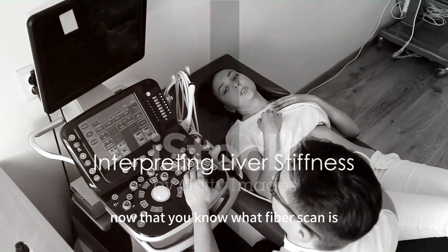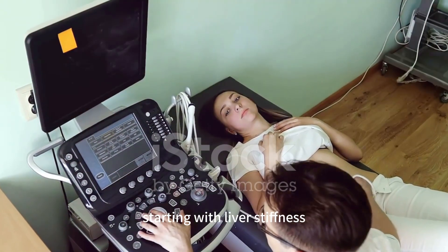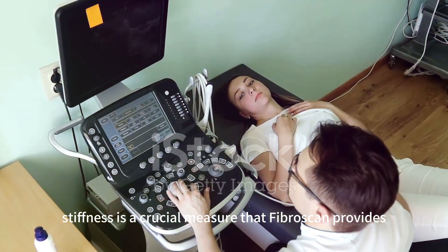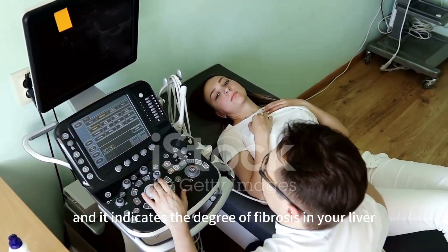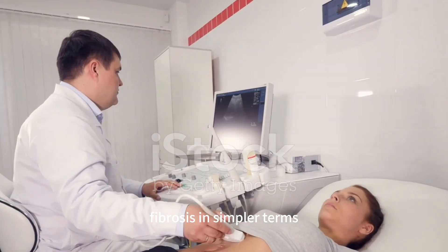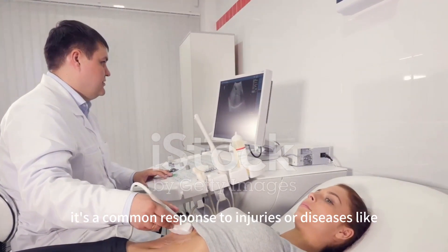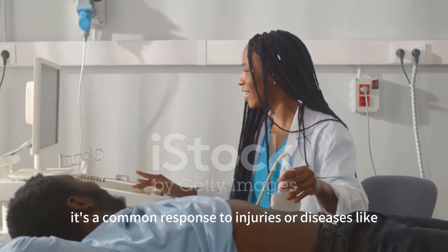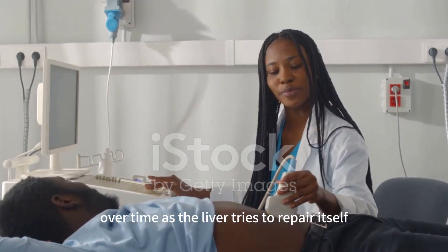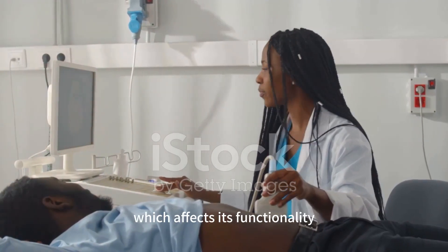Now that you know what FibroScan is, let's delve into what the numbers mean, starting with liver stiffness. Liver stiffness is a crucial measure that FibroScan provides, and it indicates the degree of fibrosis in your liver. Fibrosis, in simpler terms, signifies scarring in the liver tissue. It's a common response to injuries or diseases like chronic hepatitis or fatty liver disease. Over time, as the liver tries to repair itself, it ends up forming scar tissue, which affects its functionality.